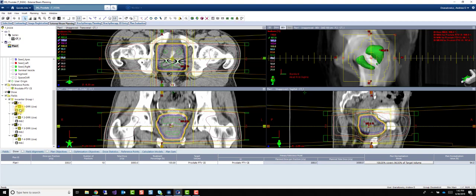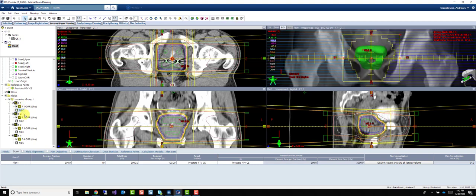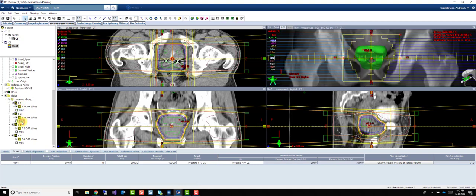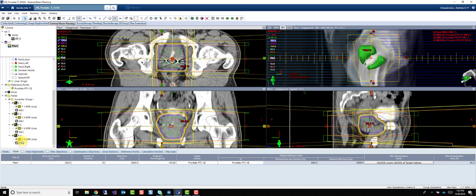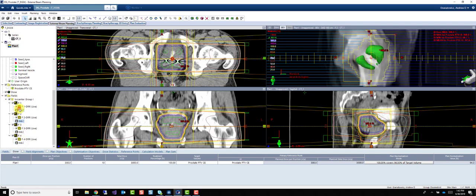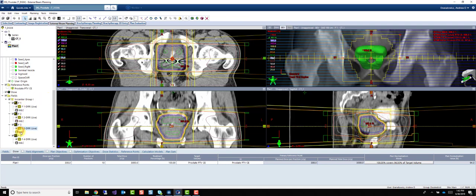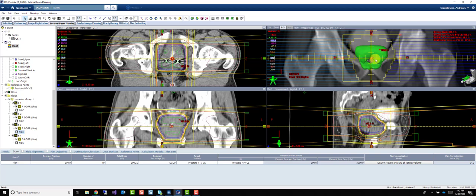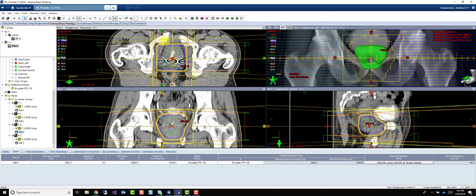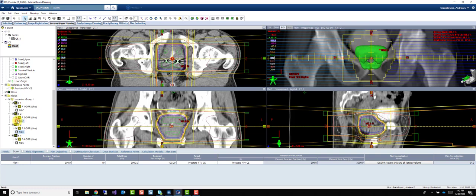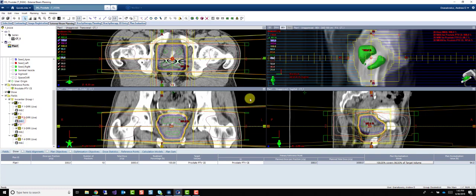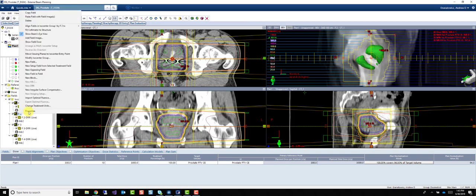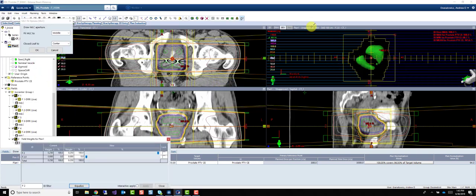So let's pick a beam to create some field-in-fields for. So just looking at all these fields, I probably don't want to pick F1 or F3. Because you can see in this projection or from this view, the 107 is covering a large percentage of that field compared to F2 and F4. So basically, the amount we have to block with our field-in-fields is going to be less. Which is what we want. So I'm going to create a field-in-field for F2.